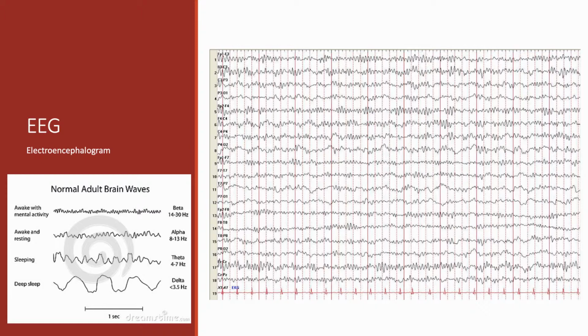Then the neurologist uses all that information together to figure out what the brain function is. So we can localize seizure activity with this. We can tell someone's wakefulness and arousability. All sorts of other things like that are useful.